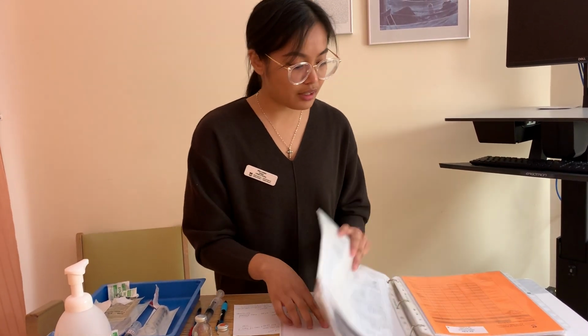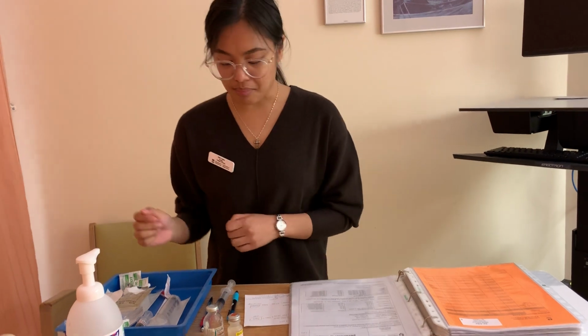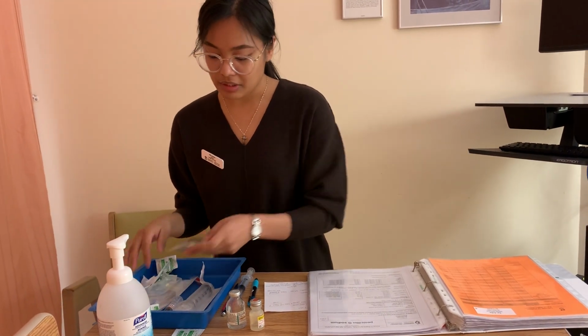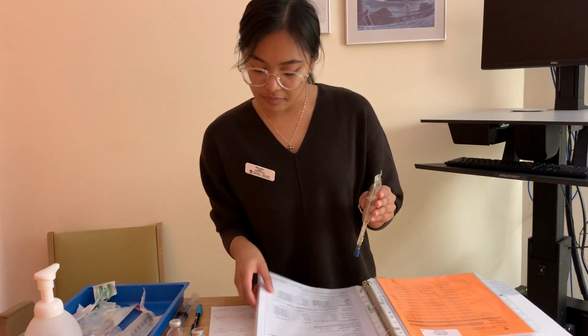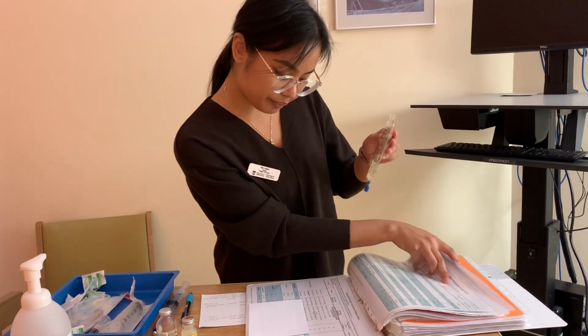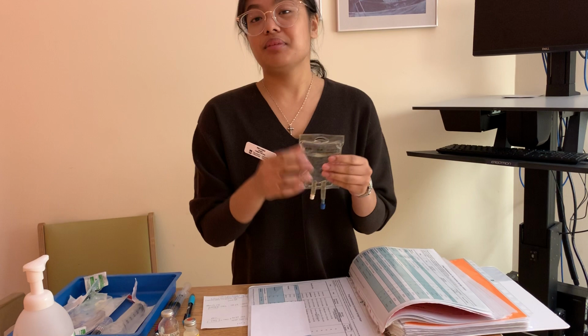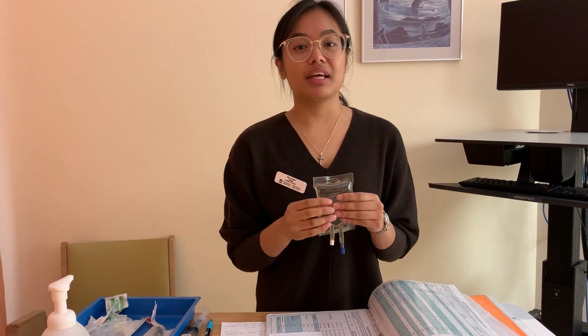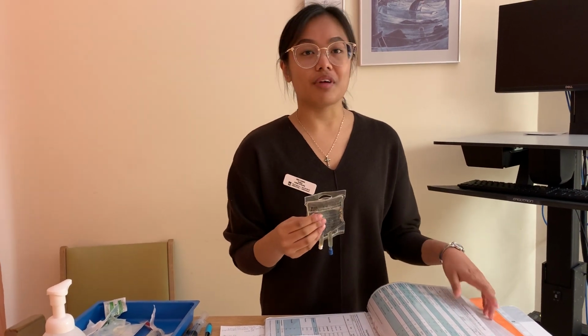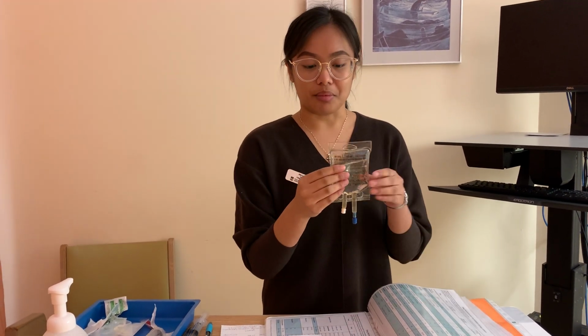Okay, and here I already have my diluent prepared. So I chose to do normal saline again. Just going to flip to my CIVA chart. I chose normal saline because the CIVA pump was already running with normal saline, so normal saline is compatible with normal saline. Also, it's compatible with my medication, and it's compatible per my parenteral drug monograph.